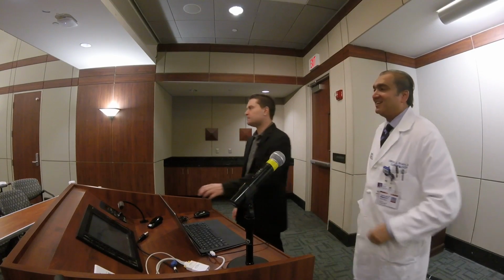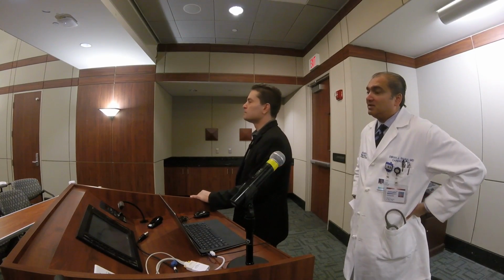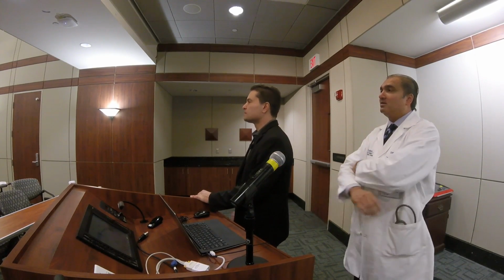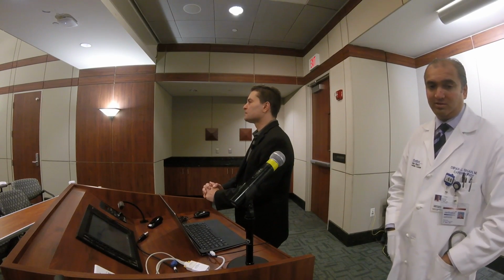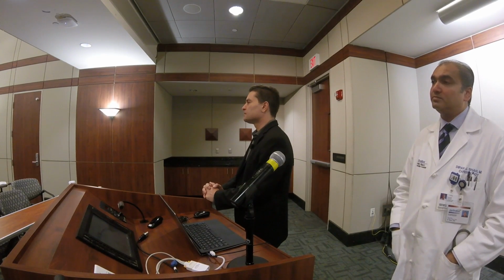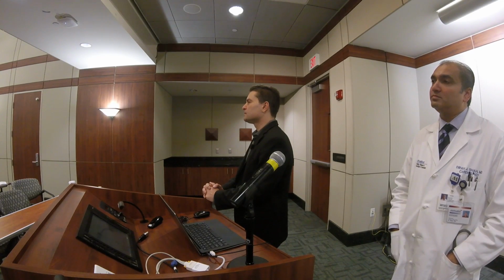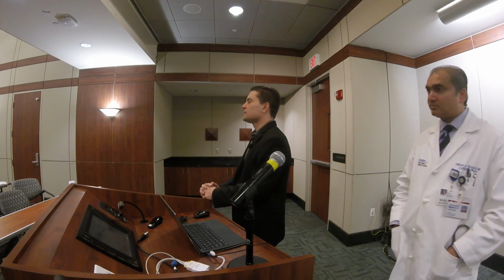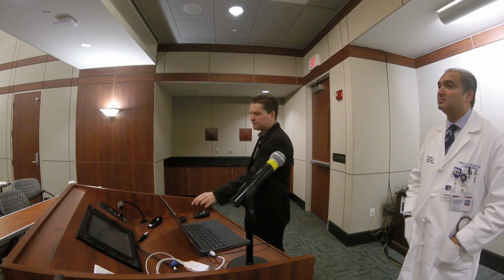Or, I'm sorry, Dale. Yeah, thank you. Very nice presentation. In my field, we study metabolism in myocardium when it's under stress. And we're looking at using PET to quantitate uptake of C11 and F18 compounds. But we need myocardial blood flow. Can the 4D flow MRI be used to calculate or quantitate coronary blood flow, myocardial coronary flow, so we can calculate extraction of these compounds, as opposed to, say, using O15?